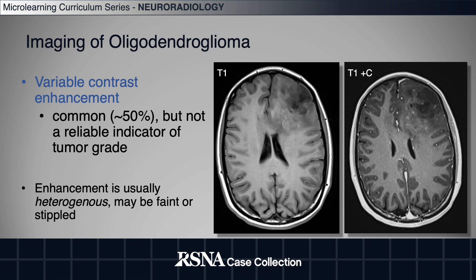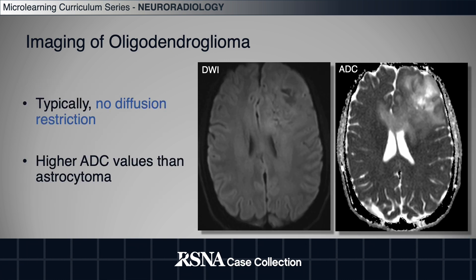Oligos demonstrate variable contrast enhancement, seen in about 50% of cases. Although fairly common, enhancement is not a reliable indicator of tumor grade — it does not necessarily predict a higher grade. When seen, the enhancement is usually heterogeneous and can be somewhat faint or stippled, as in this case.